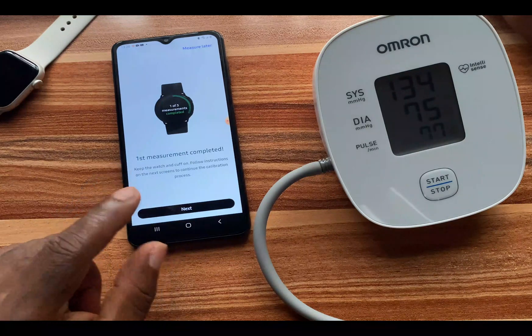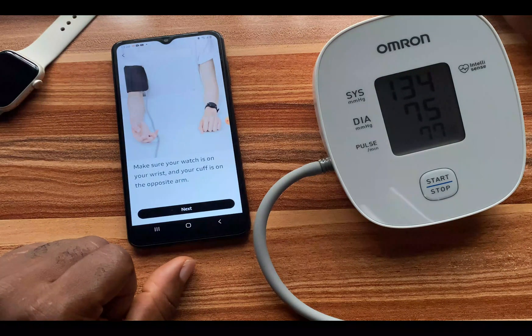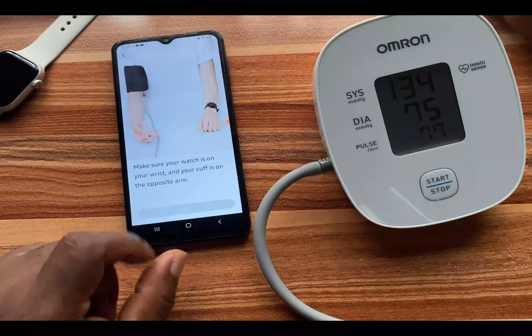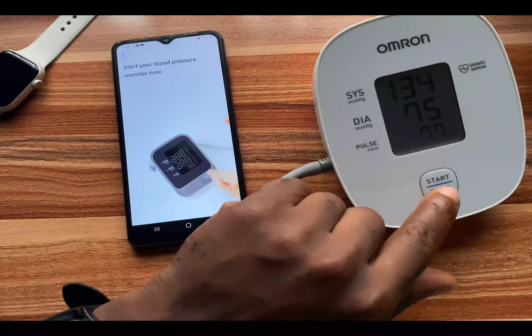We still need to keep the watch and cuff on and follow instructions on the next screen. I tap 'Next' to proceed. It says make sure your watch is on your wrist and the cuff is on the opposite arm like before. I go ahead and start the blood pressure measurement again.